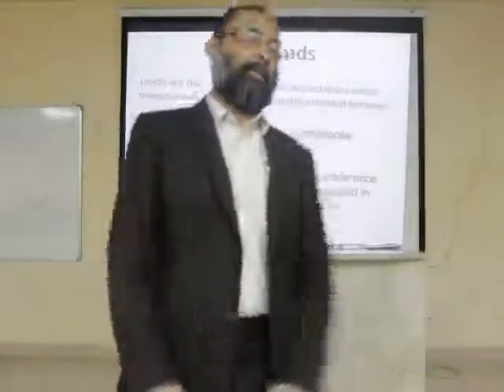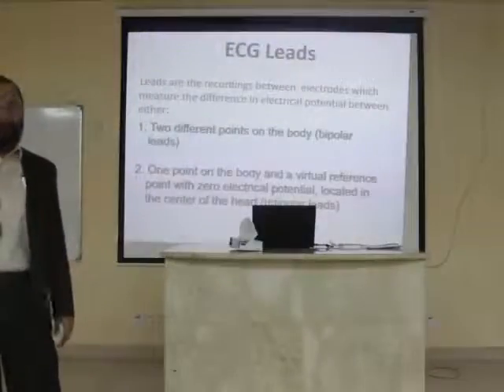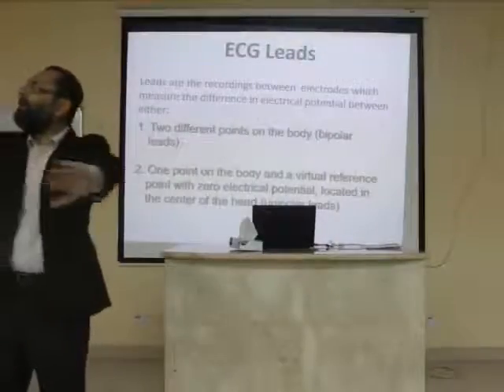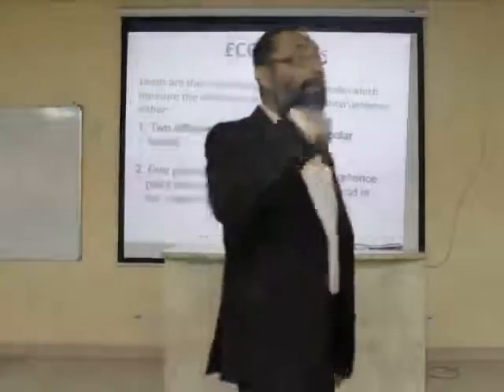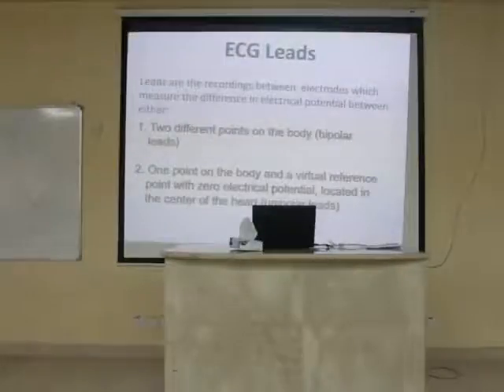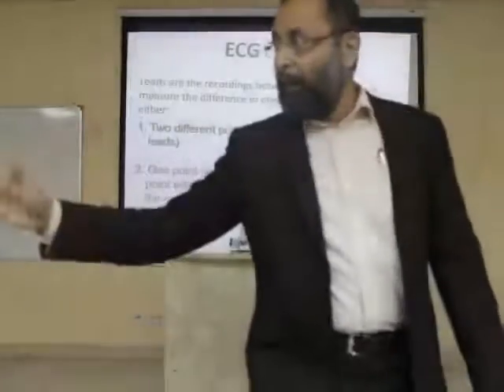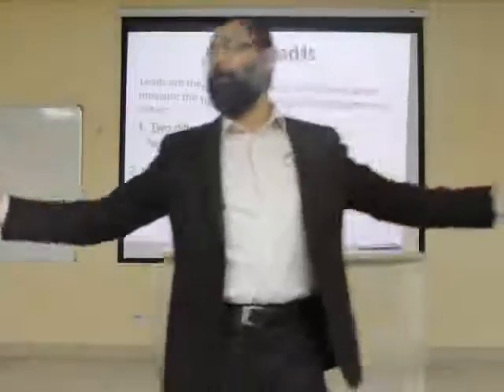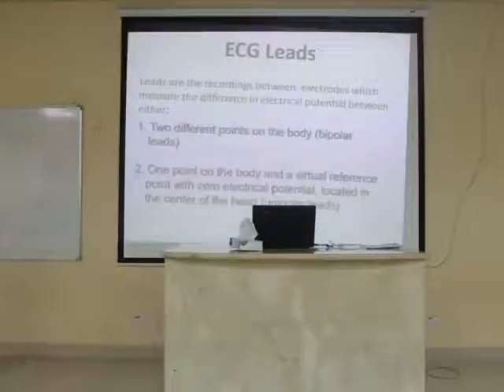6. That's it. Okay. I have given you in 2 ways the system. If I use the term bipolar and unipolar system, you say, okay, no problem. 3 bipolar and 9 unipolar. Now I say, no, I want the limb system. How many limb leads and how many chest leads? What will you say? 6 limb leads and 6 chest leads. 6 limb leads. 3 bipolar. And what about the chest leads? All are unipolar leads. Are you clear about the distribution of the leads now?